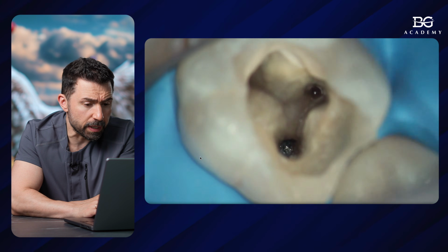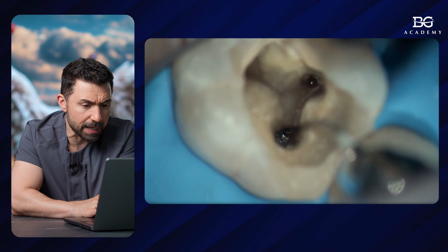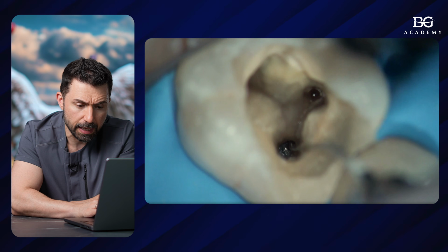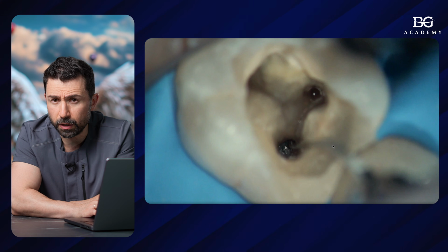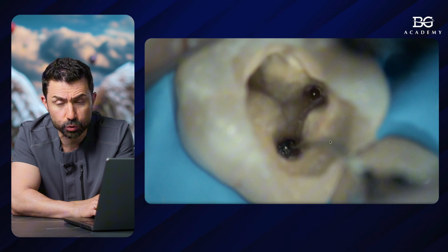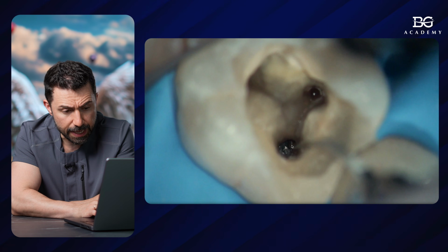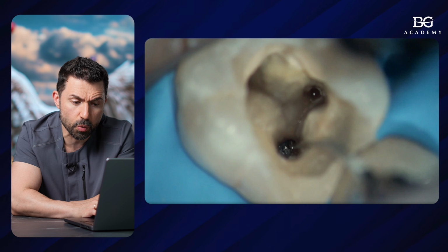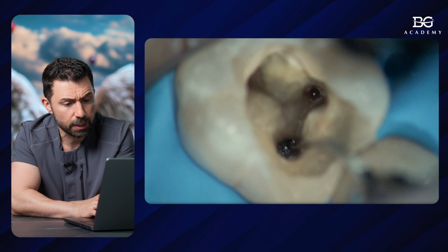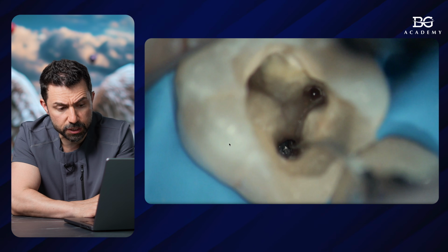Then another tip that comes from this video is the way we bend our ultrasonic file. I'll just pause the video, and you can see that the ultrasonic file is bent in two directions. One bend is very close to the handle itself, so that will give us a good visualization, and the tip of the file has to be bent towards the curvature. In our case, it comes from the buccal side.